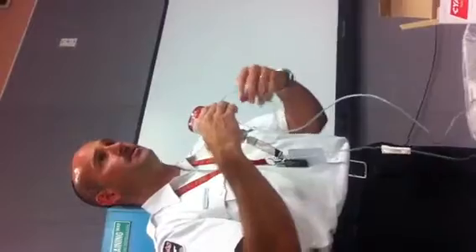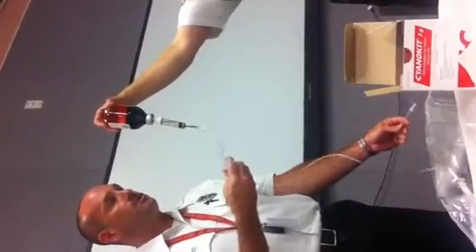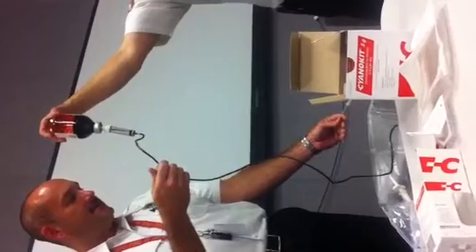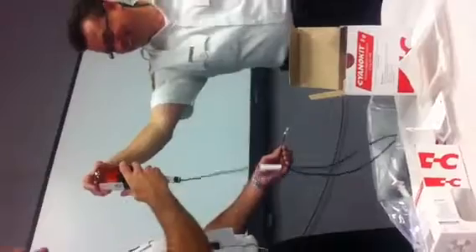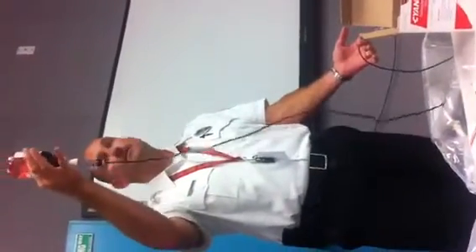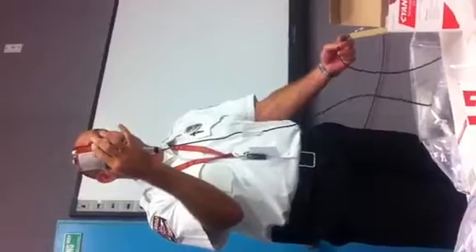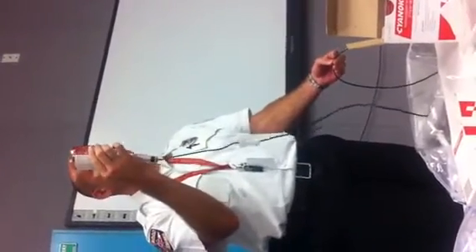In the hospital you can have pumps and other equipment available, but this is going to be out in the field where we just don't have that luxury. Look at how dark that is — it's like blood, like true blood. So this will be piggybacked into the line, and then they're going to infuse this over 15 minutes. We just tell them: take a look at the bottle in about seven minutes — they should be en route by now. In about seven minutes, half that bottle should be gone, and then the other half should be in maybe by the time we get to the hospital. It's just flowing in.